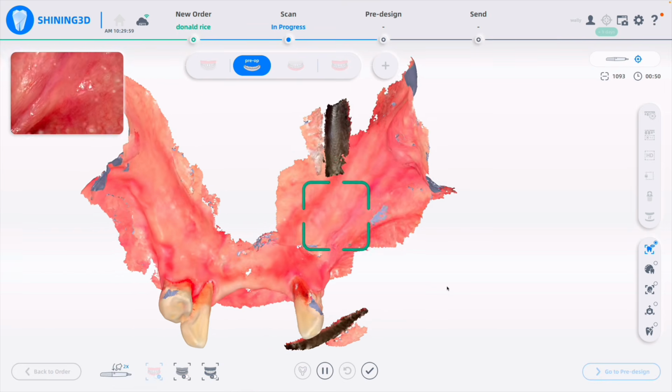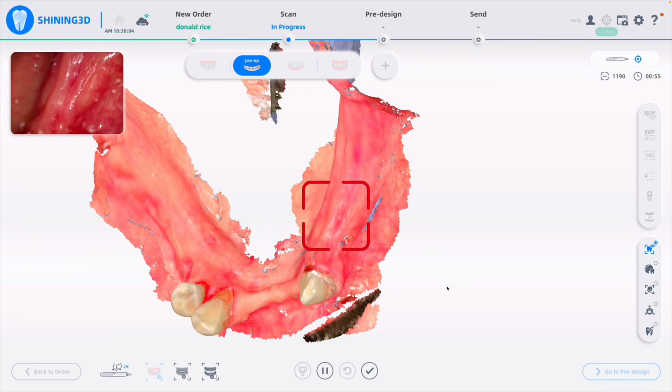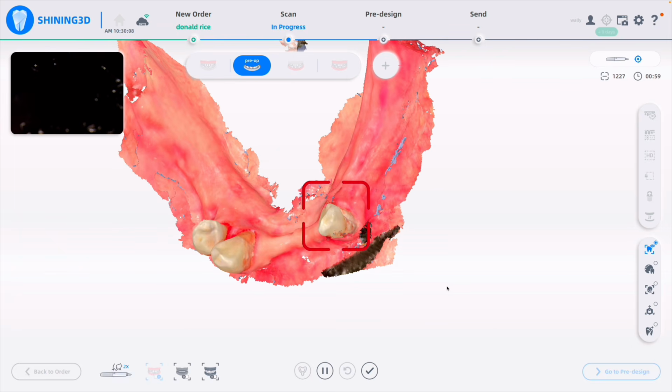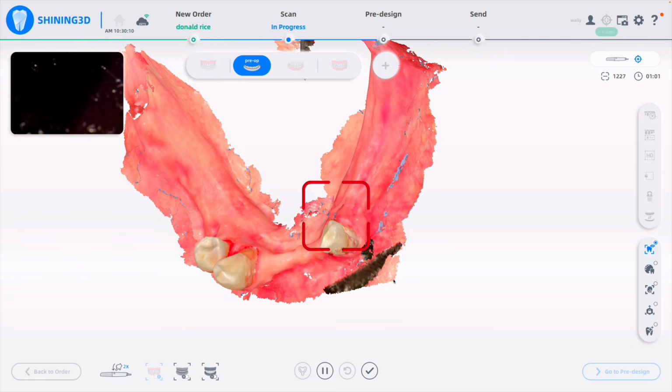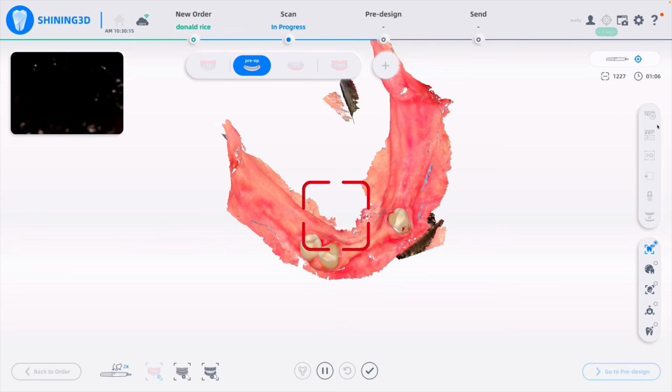There's no mobility. Look at the way this thing self-corrects scanning errors. It's insane. It has an AI system that corrects as it goes. And you'll see here, you might be thinking that this is not the most accurate of preoperative scans, but it's insanely accurate. I'll show you what I mean.